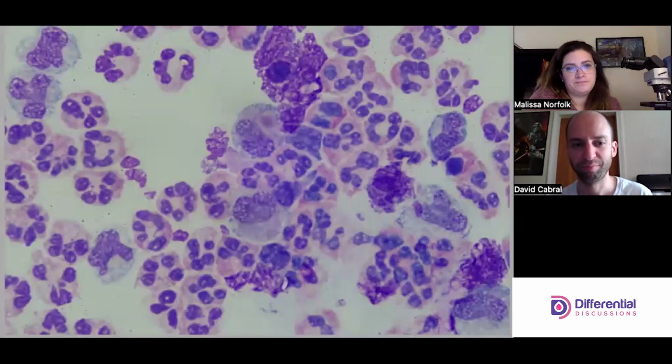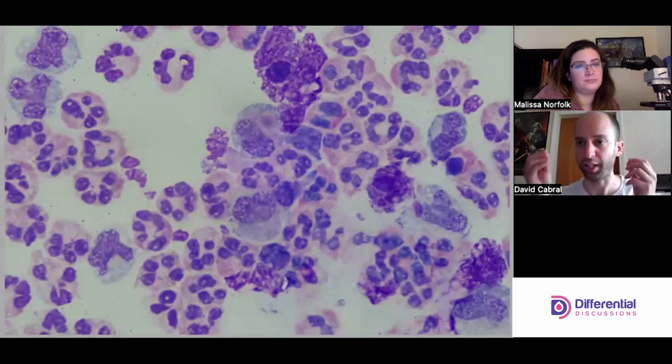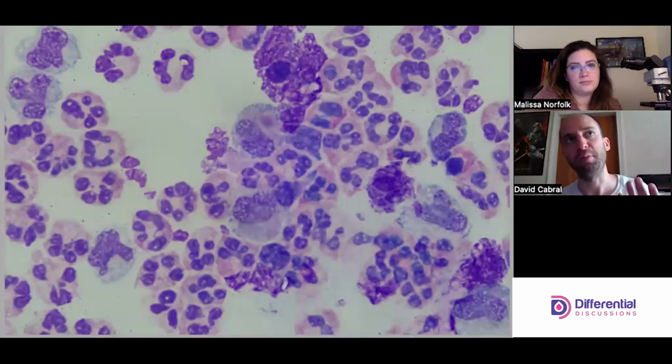And so for our purposes, Dave and I are just going to call them monomacs, because that's how we were trained. In my heart of hearts, I think that's the highest balance of utility. At some point in the community, some of us may have that skill to differentiate, and some of us may not. And how much utility are you gaining from having a bucket for macrophages and a bucket for monos?